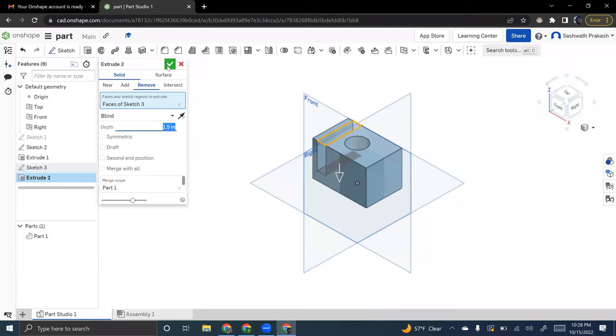Yeah, and then make that 1.5 inches. Are you good? You got it. Yeah, that's perfect. Oh, it's not a closed shape. You can edit the flare.